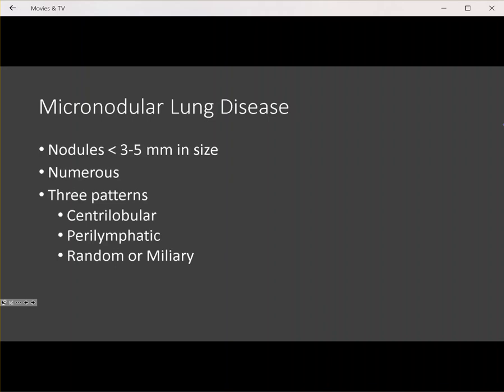The three main patterns we're going to talk about today are centrilobular, perilymphatic, and random or miliary. When someone asks you for the differential for micronodular lung disease, you first have to identify the correct pattern: centrilobular, perilymphatic, or random/miliary.